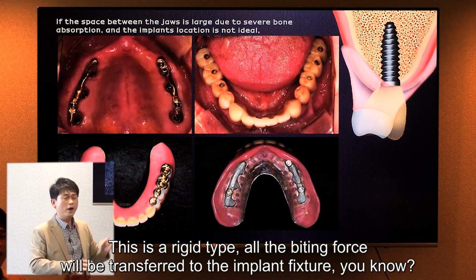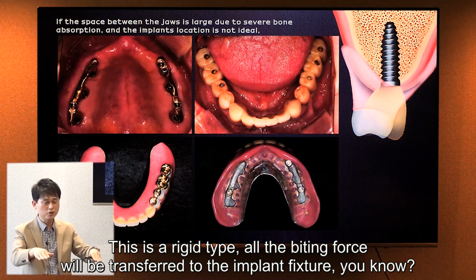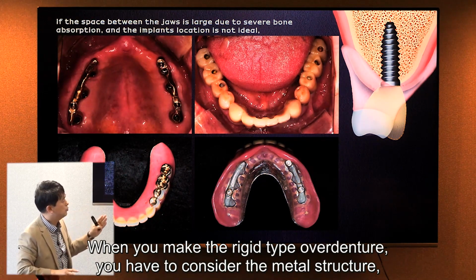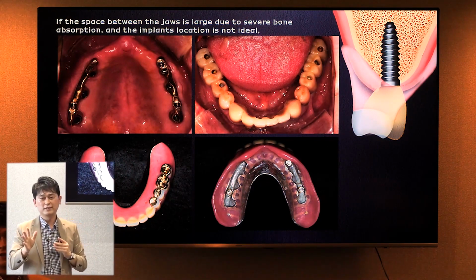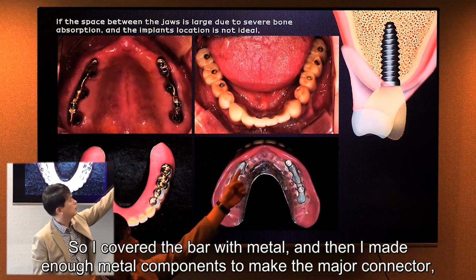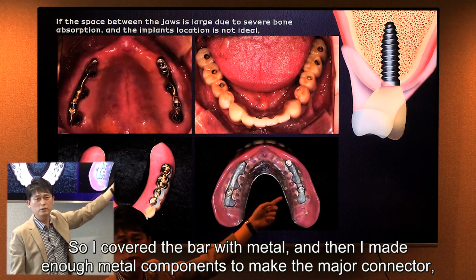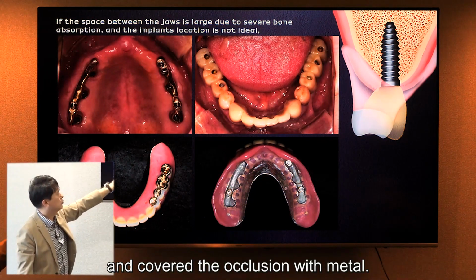This is the rigid type. Every biting force will be transferred to the implant fixture. So when you make the rigid type overdentures, you have to consider the metal structure to enhance the strength. So I covered the bar with metal, and I made enough metal component to make the major connector, and covered the occlusion with metal.